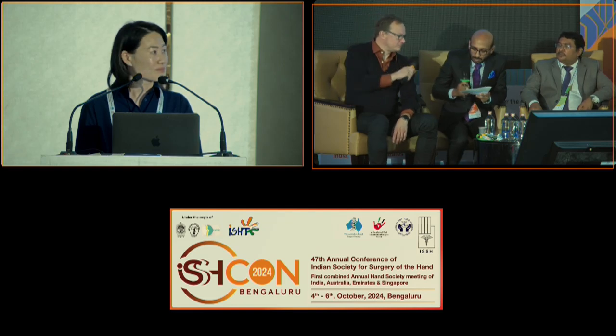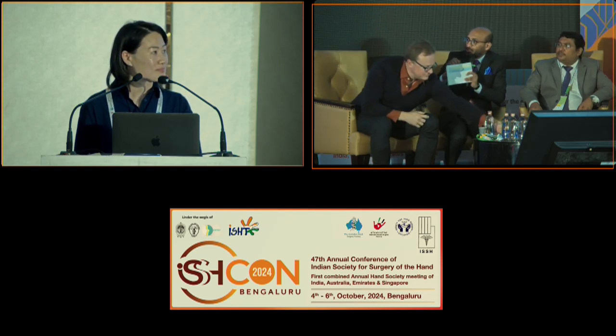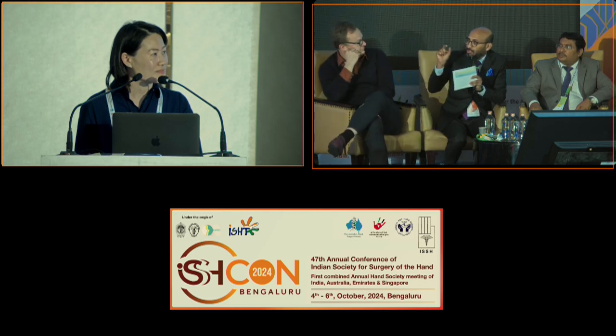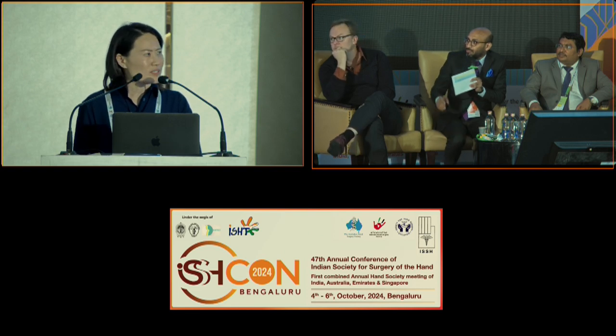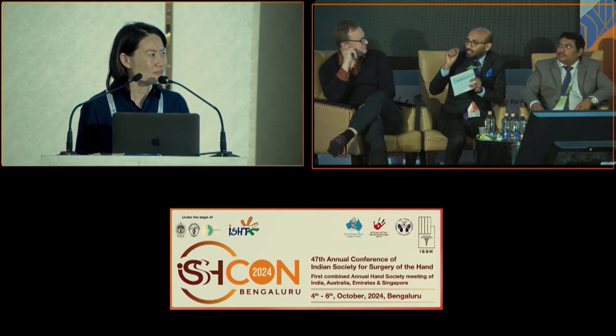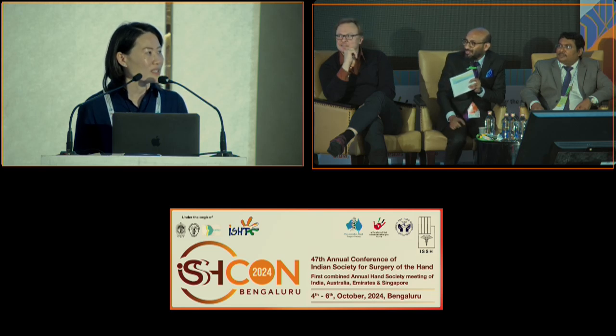Can I just want to know what is the usual size of tenodesis screws you use in lunate and how often you are able to use? These lunates are so small, so what is the size of the tenodesis screw you are able to use, especially if I'm not mistaken, it's about 3 or 4 millimeters. It's from the Arthrex, a small tenodesis screw, the smallest, because in our population, we find that using it in lunate is quite too small. That's one difficulty.